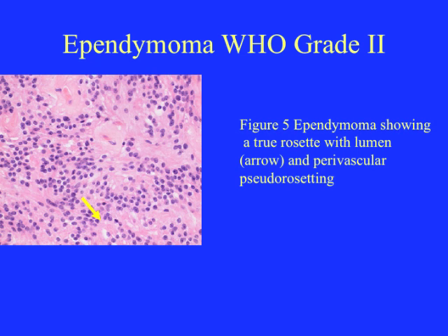This is an ependymoma WHO grade 2, which can be seen typically in the posterior fossa of children or in the spinal cord of adults. Ependymomas show true rosettes with lining up of tumour nuclei around a central lumen, pointed to by the yellow arrow, and can also show perivascular pseudorosettes — lining up of tumour nuclei around blood vessels. There is also an anaplastic version, WHO grade 3, which is not shown here.